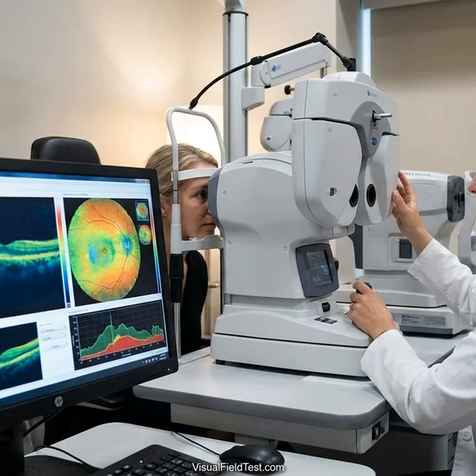Mild to moderate glaucoma. Typically, specialists will do an OCT and exam about every 6 to 12 months. A recent review suggests that twice-yearly OCT is generally sufficient to catch important changes. If an eye is stable for years, some doctors stretch it to annual. But if any risk factor is high, like high pressure, disc hemorrhage, or rapid field loss, they will do scans more frequently, e.g. every 6 months or even 3 months to make timely decisions.